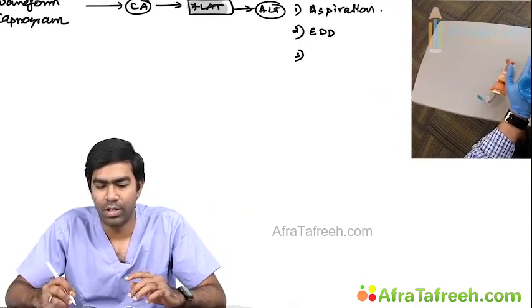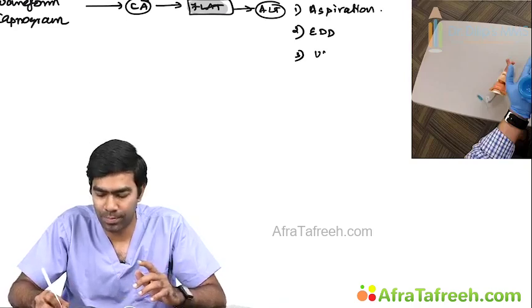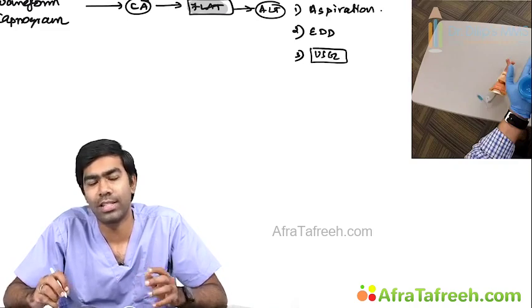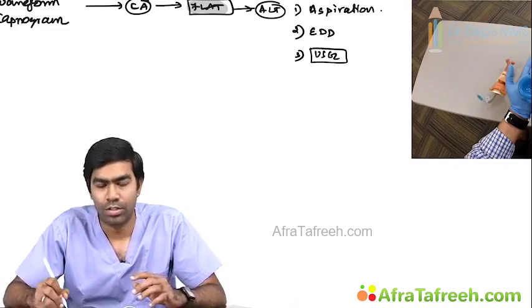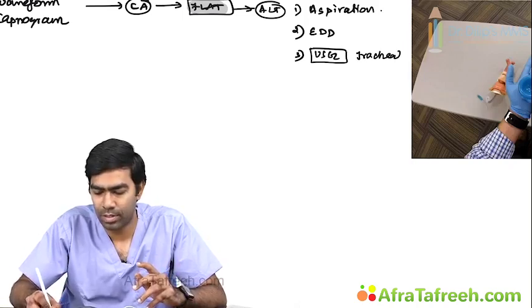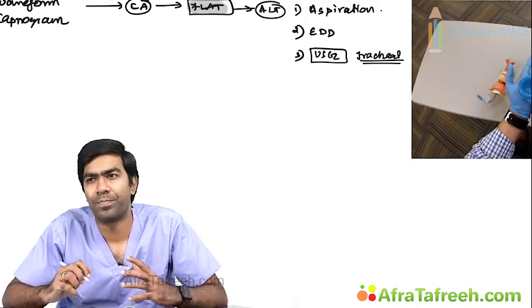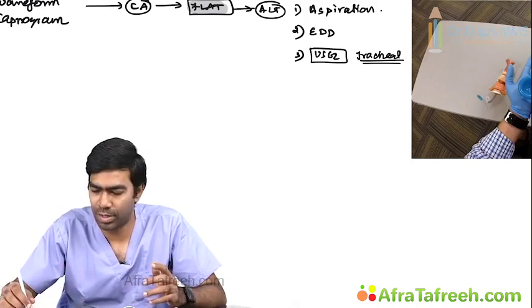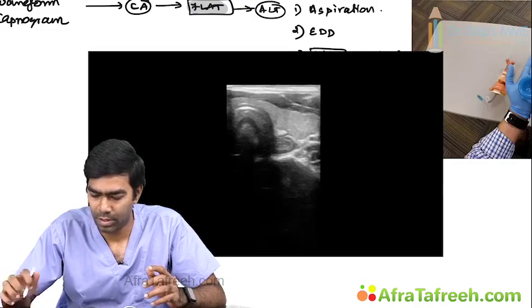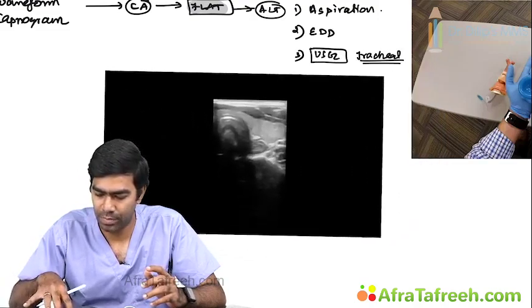And number 3, now ultrasound is also coming. Ultrasound is emerging as one of the very powerful tools in these scenarios. So how can you use it? You are going to use the tracheal ultrasound. So you have to demonstrate it. Let me show how tracheal ultrasound will work. So let us see this video.